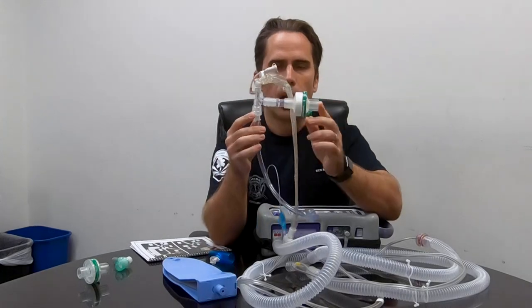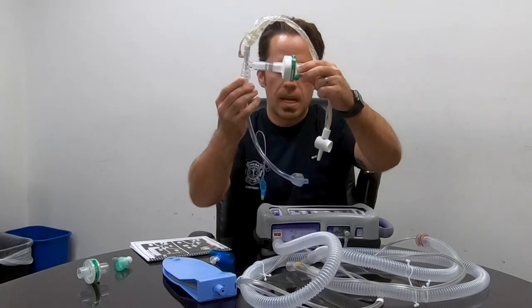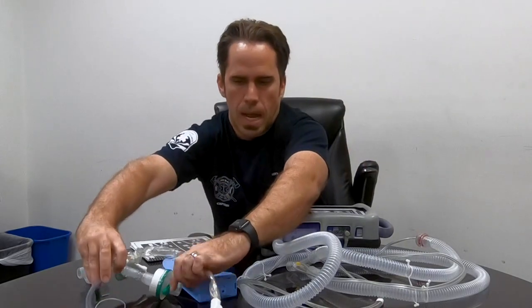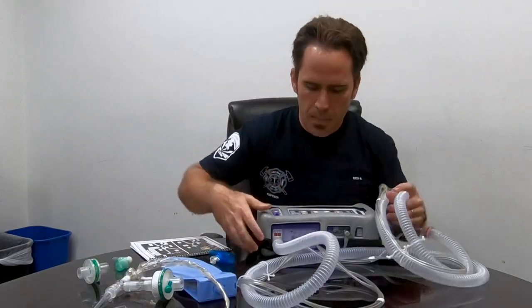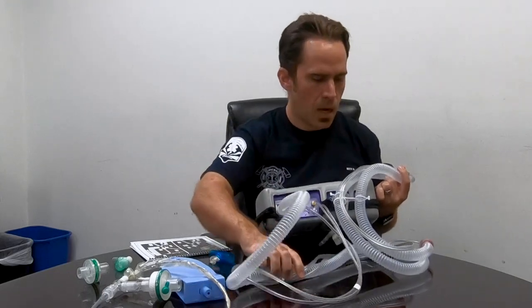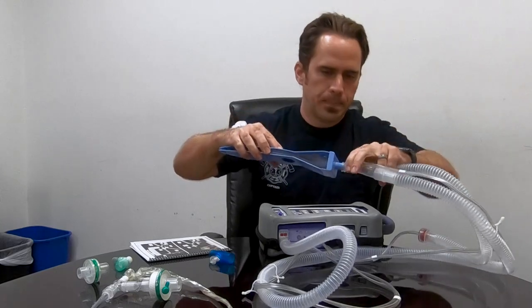I don't set this full patient circuit up every day — only when it's on a patient. But every day I set up a test circuit with a test lung to practice. I flip open my ventilator book to the invasive intubated setup and just follow along with the pictures.